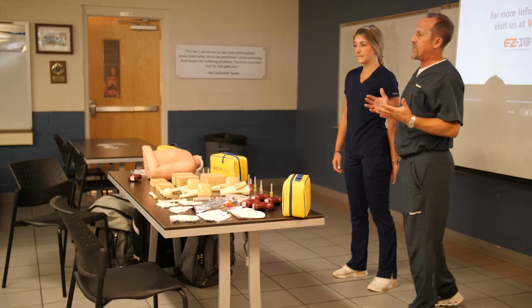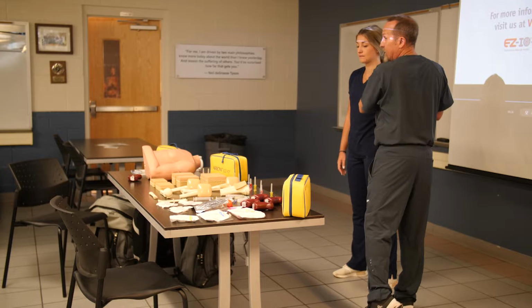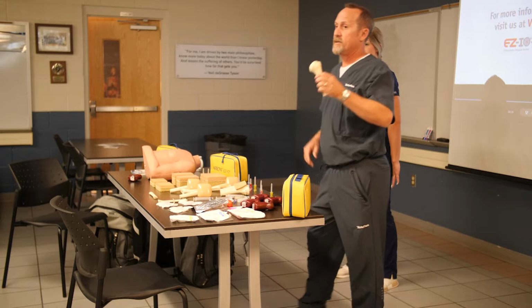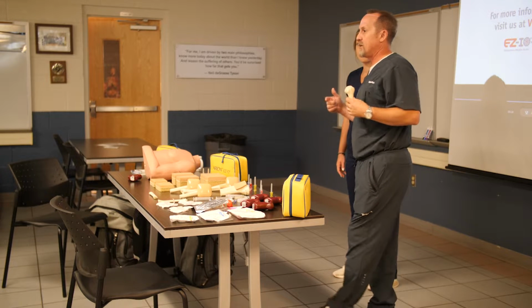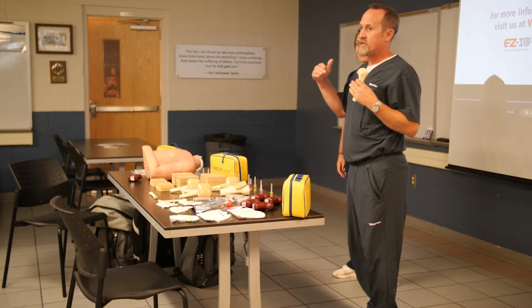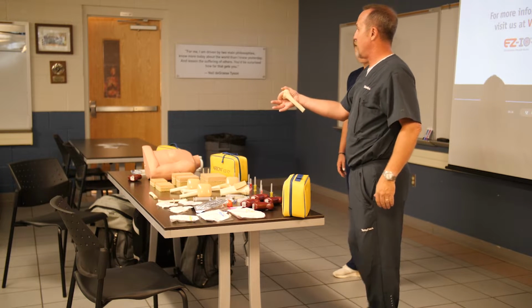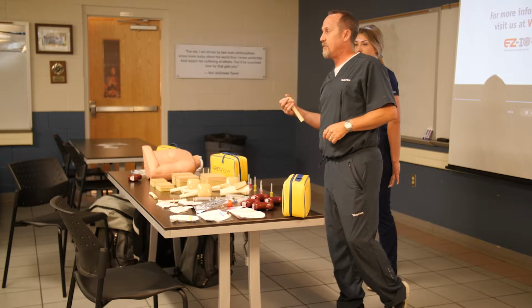So I think when you guys start doing these more frequently, you'll get really comfortable where you can just kind of landmark it here. And now remember, when we're going into the proximal humerus, that's a huge target right there. We don't have to get a protractor and a ruler and try to figure out this spacing and everything. We're going for a pretty big size. It's almost the size of a quarter. As long as you're somewhere in the middle of that, you're going to the right spot. Does that make sense to everybody?